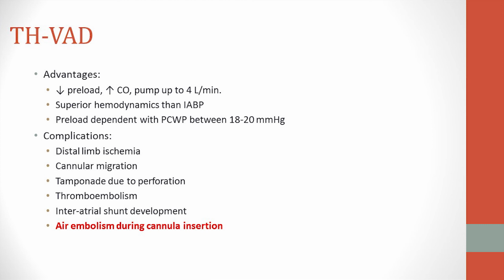Its benefits are without question. However, the potential complications could be catastrophic. Percutaneous placement requires experienced operators familiar with the technique of transseptal puncture. In our case, it appeared that our patient suffered from pneumocephalus, presumed secondary to significant air introduction to the closed-loop system upon device implantation.